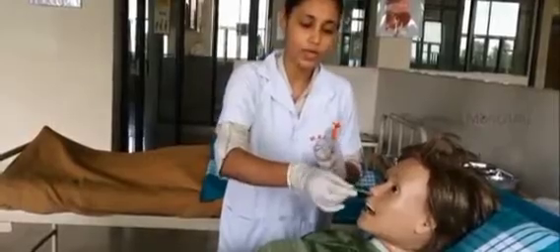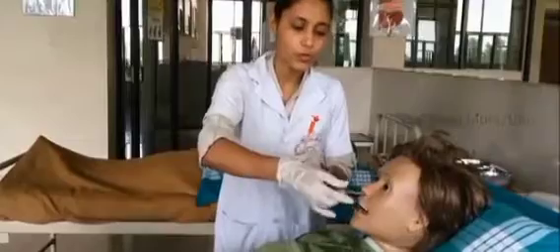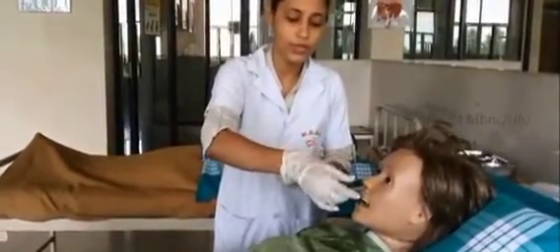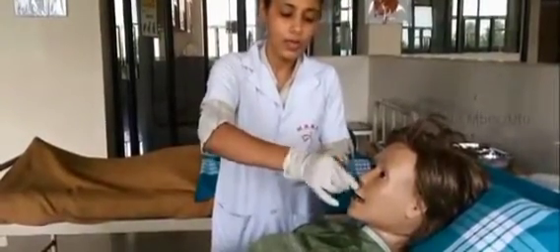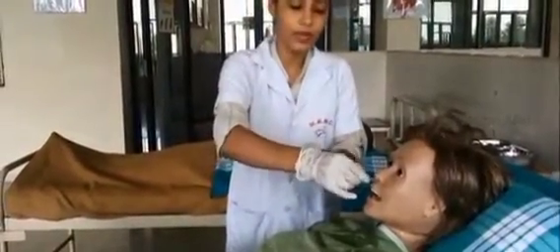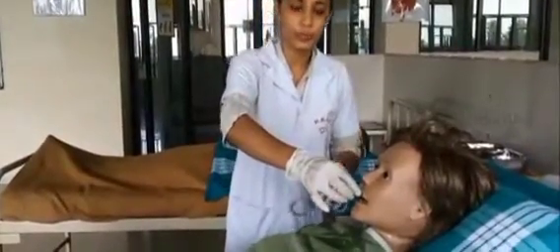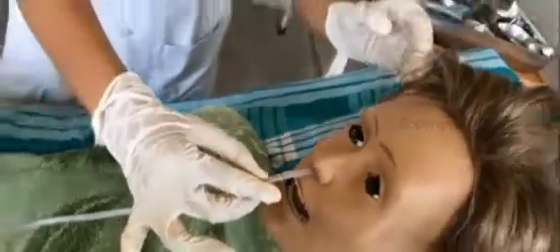Now as we continue, tell the patient to swallow, swallow, swallow, so it is easy to insert. We have measured between 50 to 60 centimeters, so we have to introduce till that. Okay, now it is already 50 centimeter, it is going up. Here the 60 centimeter will be there, so we have inserted more than 50. So this is the insertion of the NG tube, according to the measurement we have done, between 50 to 60 centimeter.